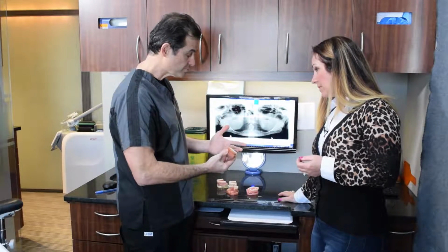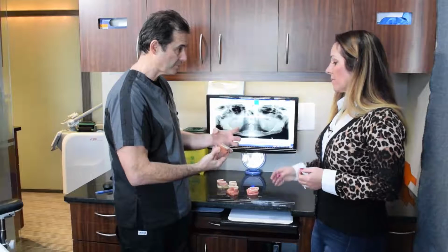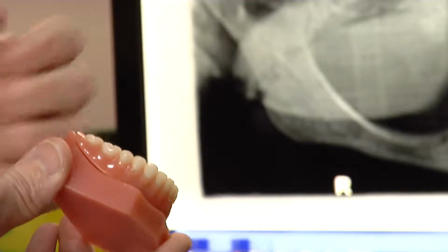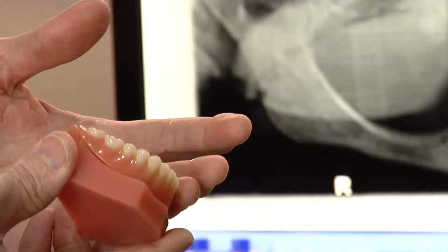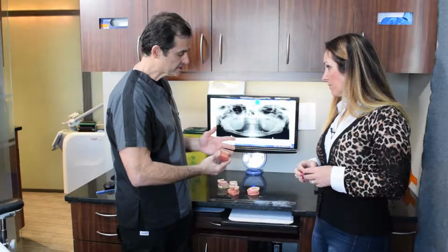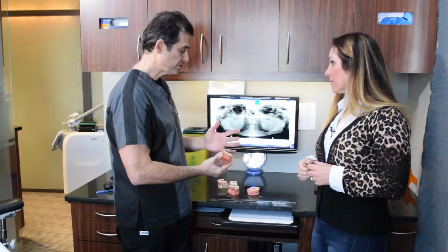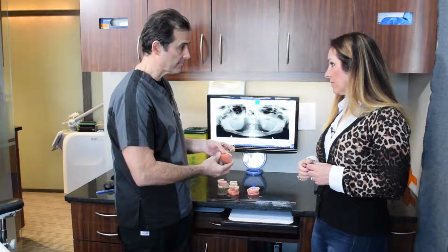But this is much better than having denture pastes. This certainly will at least leave your denture in place, so when you're eating, it's not flipping around on you, and people can have some function returned with this. I feel like it would give you a little more confidence too. Yeah, just to know that it's there. Absolutely. This treatment is probably best for people who've been wearing a denture for a long time, who don't mind wearing a denture, but they want it to just stay a little bit better.